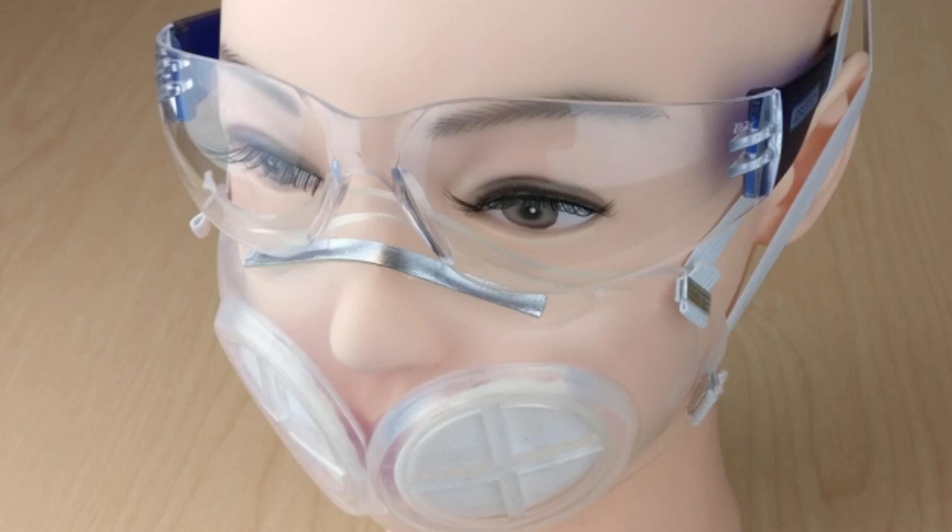The researchers tested several different sterilization methods on the silicone mask, including running them through an autoclave, putting them in an oven, and soaking them in bleach and in isopropyl alcohol. They found that after sterilization, the silicone material was undamaged.